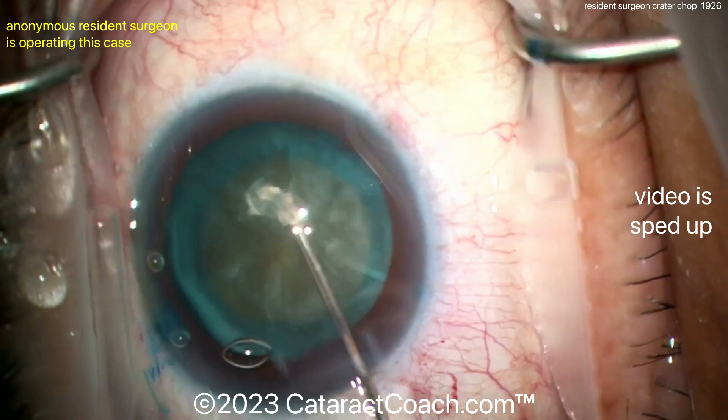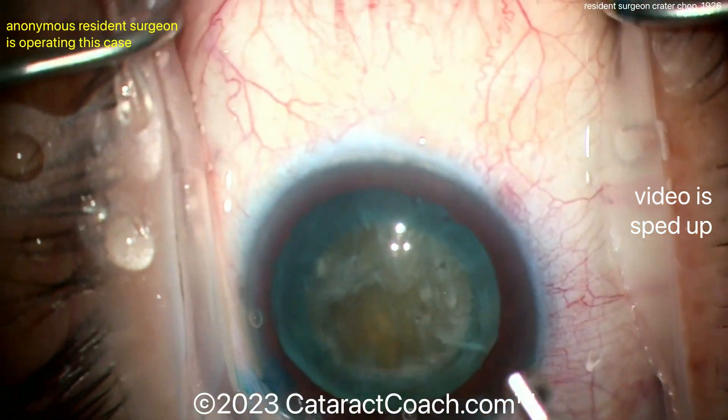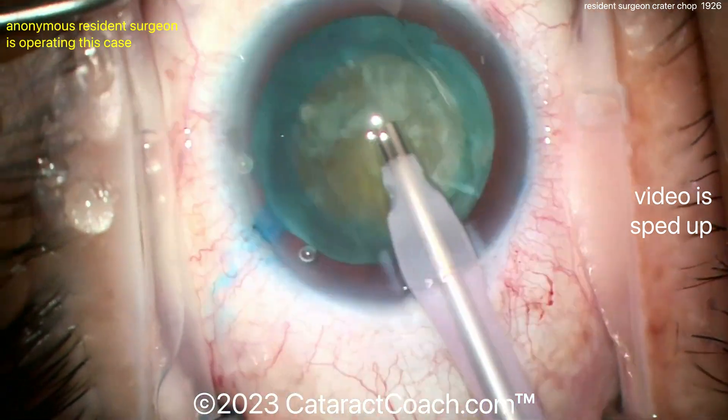Let's see if it rotates. You know the saying: if it does not spin, you will not win. That's especially true for a resident. If you're not a surgeon who's done a million cases, it matters — you want to confirm rotation.